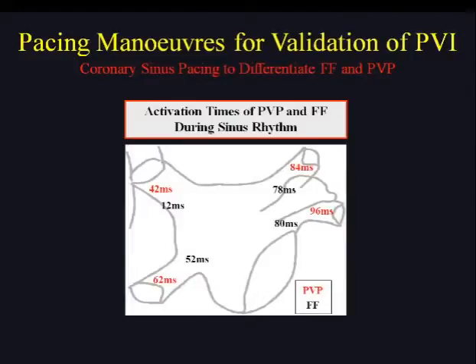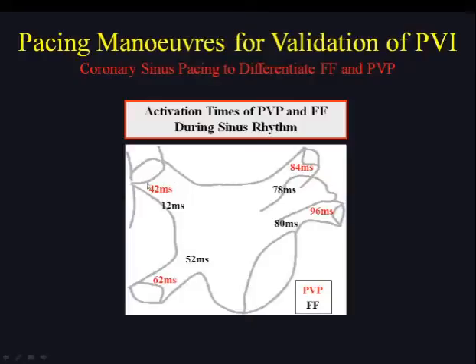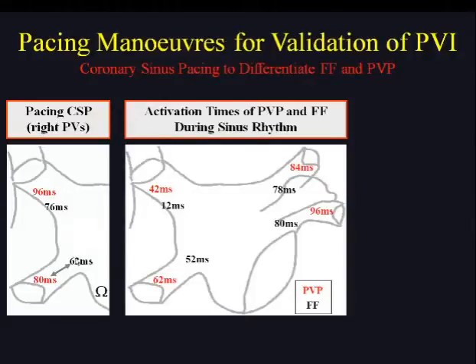The first differential pacing mode uses only your coronary sinus catheter — no extra catheter is needed transeptally. Looking at the activation times of potentials on the PVAC trace during sinus rhythm: the far-field activation and PV potential activation times are almost overlapping for most veins. Only for the right superior pulmonary vein is there already a differentiation. For the right inferior pulmonary vein, pacing the proximal coronary sinus easily differentiates the far-field potential from the PV potential — a maneuver used consistently for that vein.